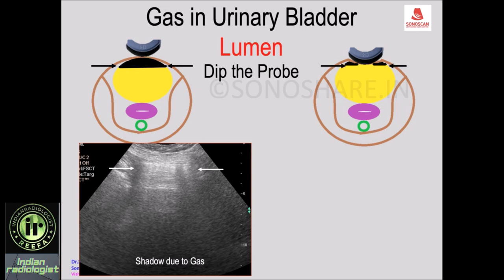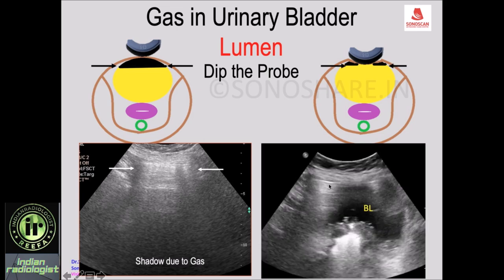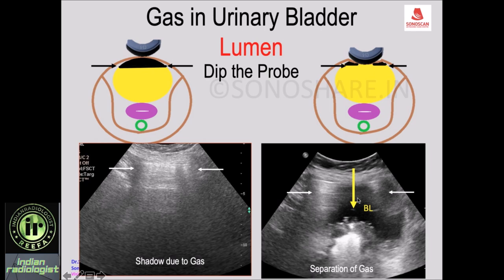As a result, we get two echogenic lines on either side producing dirty shadows, whereas in the center, because the gas is displaced, the ultrasound can travel through the urinary fluid and you are able to see the structures posterior to the bladder — here there is the rectum. Without dipping, you do not see the posterior structures because of shadowing.